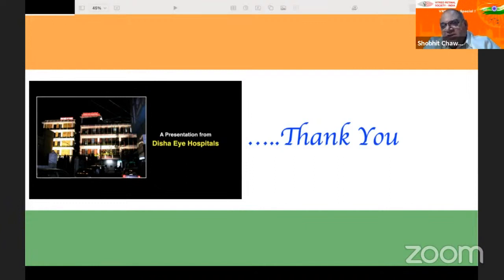Where retinectomy is desired, what is your gauge preference, 25 gauge or 27 for a more controlled retinectomy? Because we are using 25 gauge mostly. Yeah, I use 25 gauge. I've done several hundred cases with 27. It works fine for me, but I train fellows, and I find that the fellows have a tendency to bend the instruments at 27 gauge. Wound leaks are very rare anyhow, but less with 27 than 25. So if I didn't train fellows, I would use 27, but I do train fellows, so therefore I use 25.